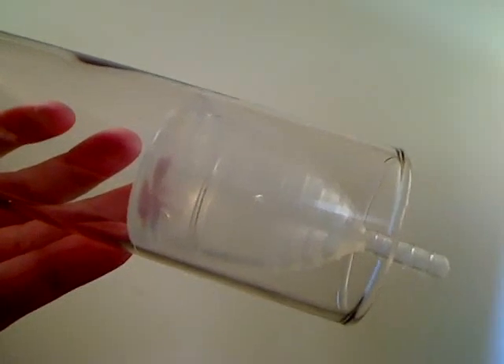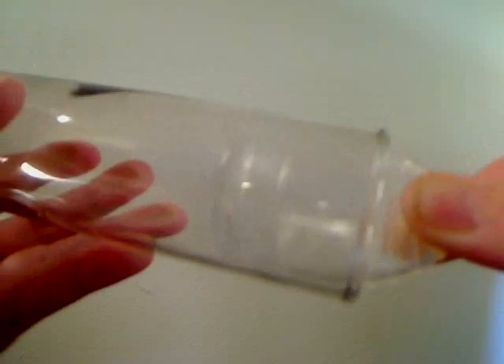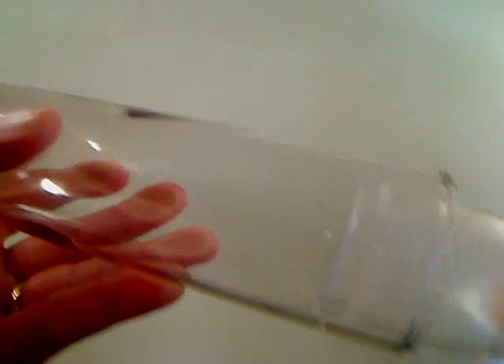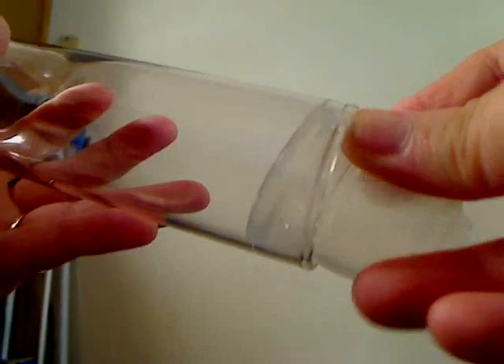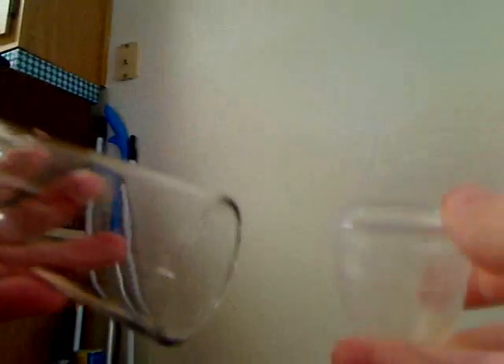When the cup is full, the easiest way to remove it is you pinch the bottom, and you tilt it from side to side — left, right, left, right — and then you just ease out one edge of the rim, and you hold it in an upright position like that. Afterwards, you empty it in the toilet, wash it, and then you fold it and reinsert it.